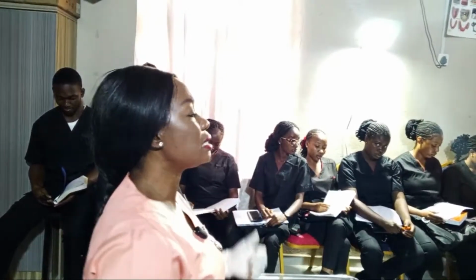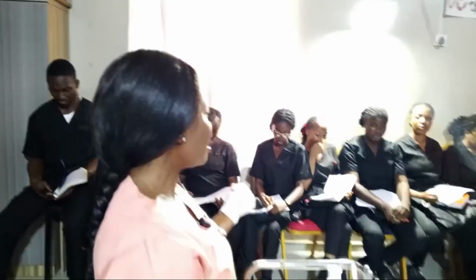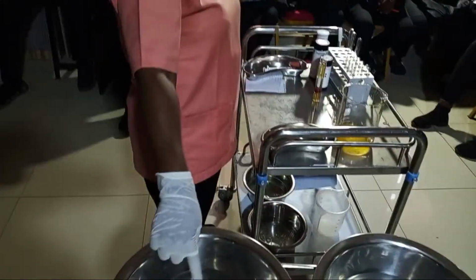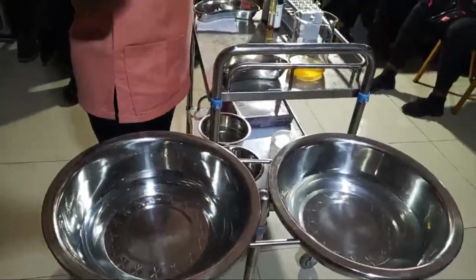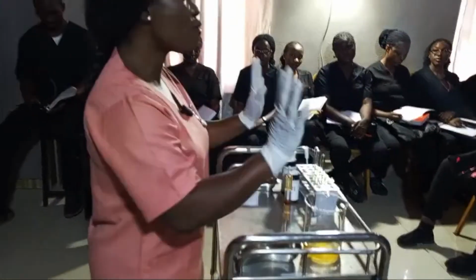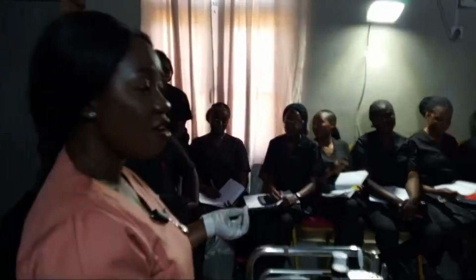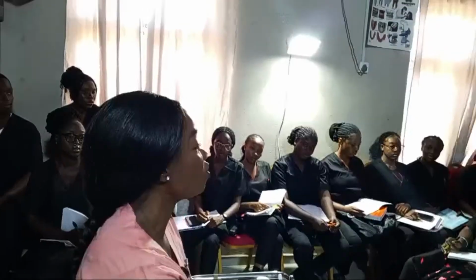The color of the urine: is it amber, is it deep amber, is it clear? When somebody takes a lot of water, the urine will be as clear as this water, right? If the urine is clear, that means that person is taking enough water. But if the patient is not taking enough water, it will be deep amber, right? So what's the next thing? Yes, amount, of course. We said that if you want to check amount, what will you do?